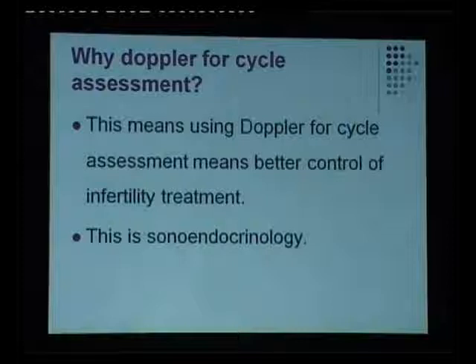This study again has shown that, of course, there were several studies done earlier on B mode and the routine Doppler, and they had controversial reports. Some said that the PCO ovaries had higher blood flows, and some said they had lower blood flow, but 3D power Doppler, because it measures the global vascularity, has clearly shown that the PCOs have higher VI and higher VFI values, so it has a higher vascularity.